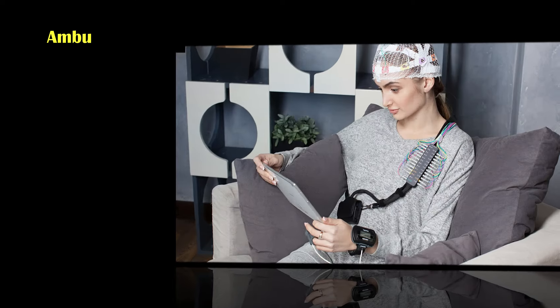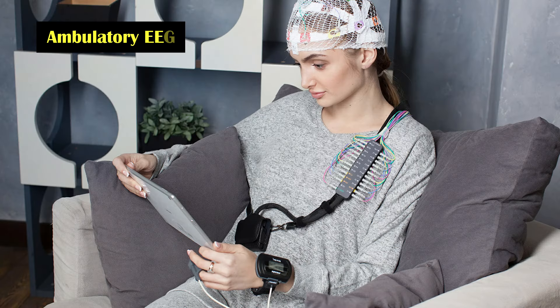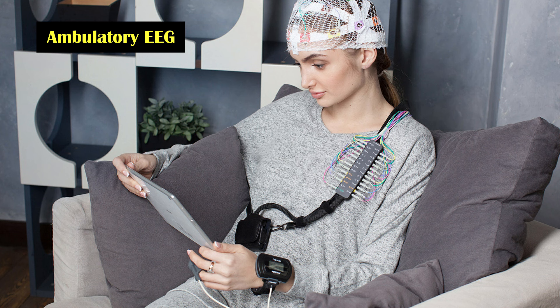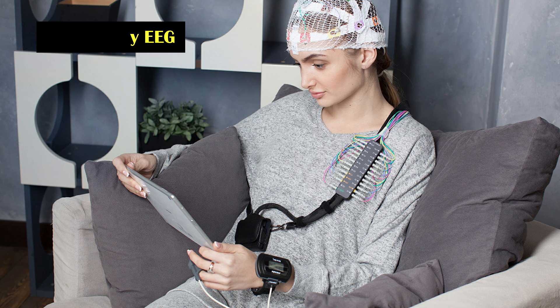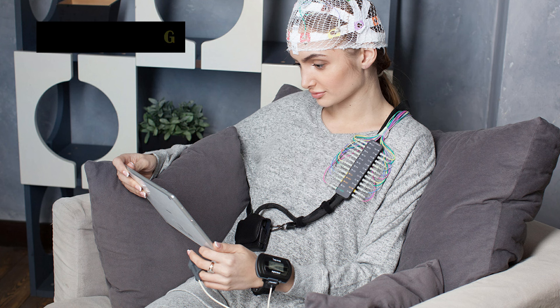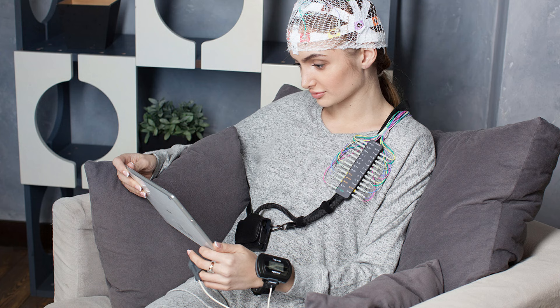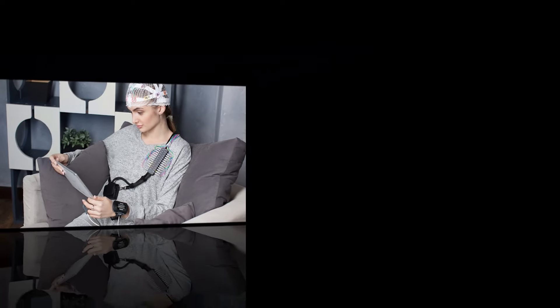An ambulatory EEG is where brain activity is recorded throughout the day and night over a period of one or more days. The electrodes are attached to a small portable EEG recorder, and patients can continue their normal daily activities during this test.